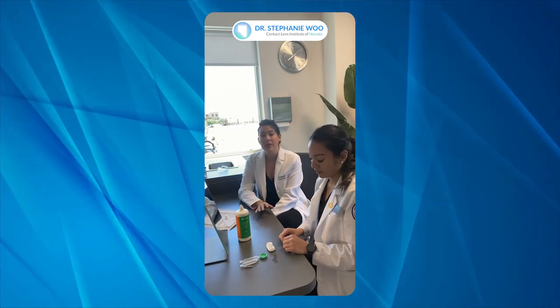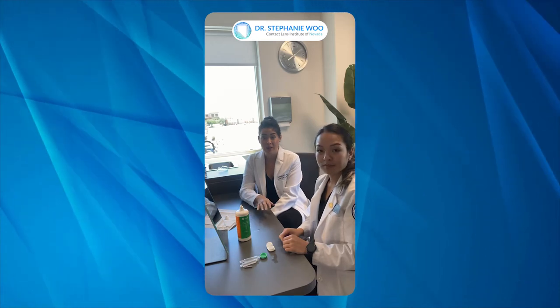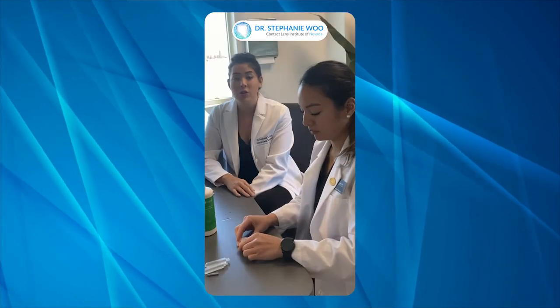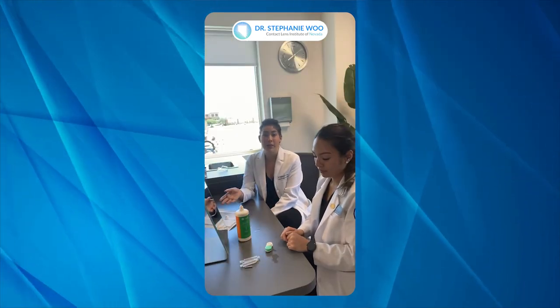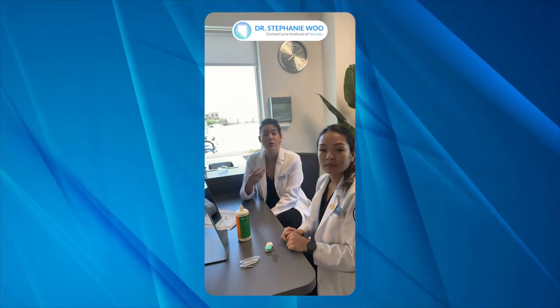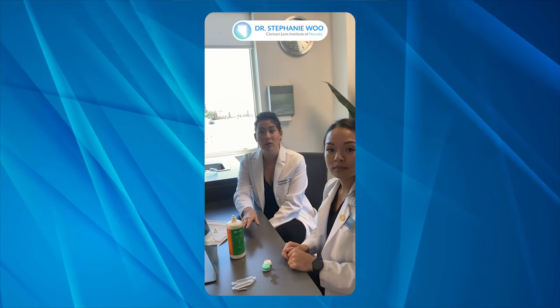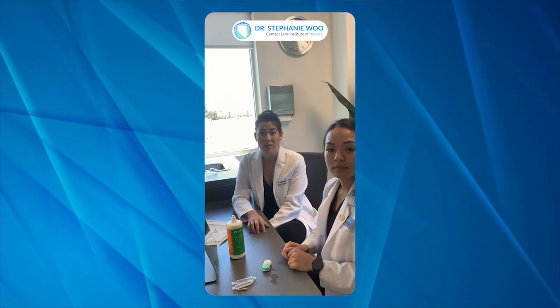After she has filled the lens well and made sure the entire surface of the scleral lens is covered, she's going to take the lens case top, screw the cap on tightly, and let it sit overnight. Each manufacturer has different recommendations for how long the lens needs to sit to complete the disinfection process. Most are between four and six hours, so make sure you check the back of the bottle or the box to confirm the full disinfection time.